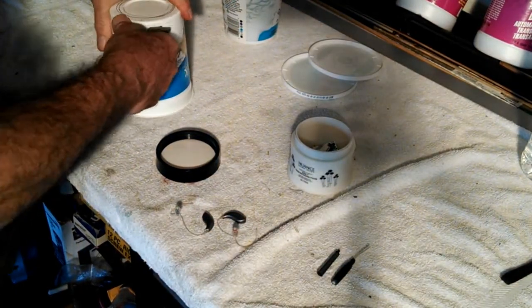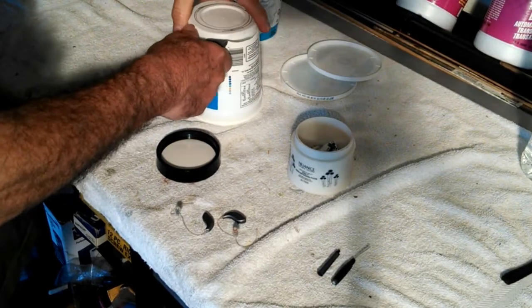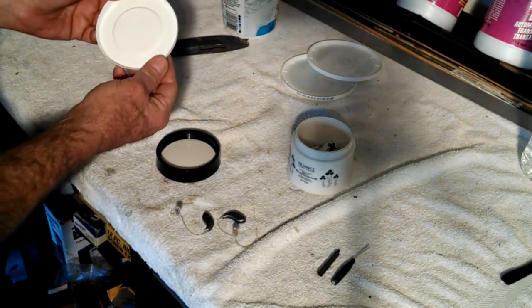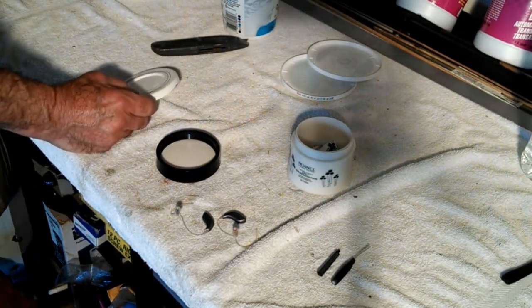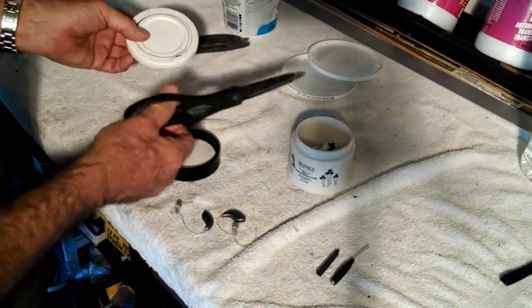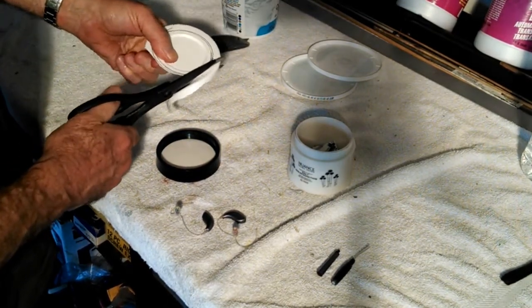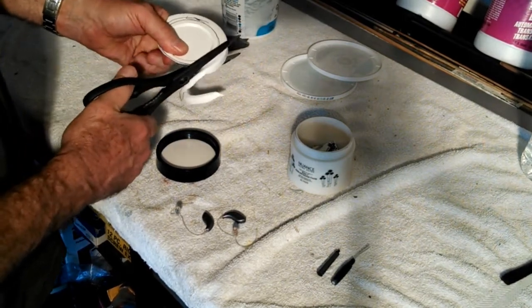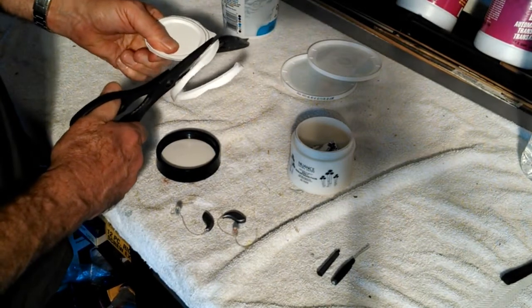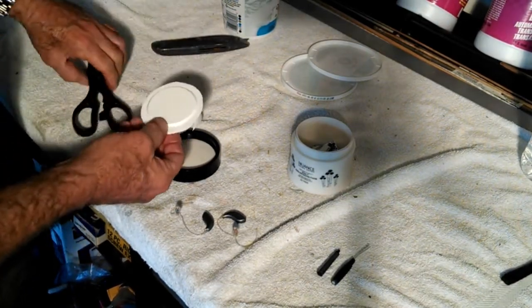First thing I want to do is just cut the bottom off. There we go. And then I'm going to take some scissors and make another cut. I've already drawn a circle that's equal to the diameter of the hole that's going in.